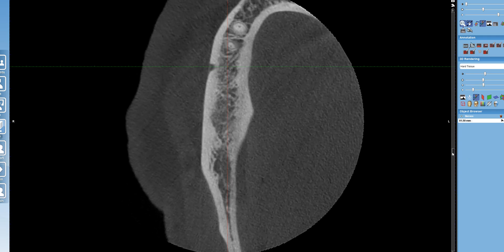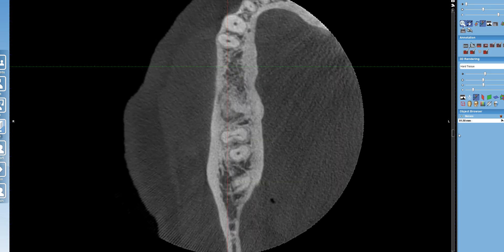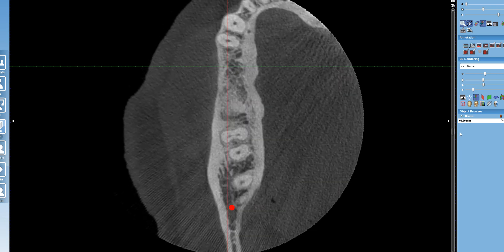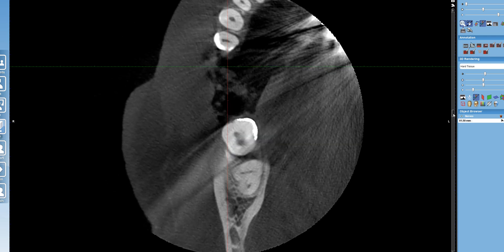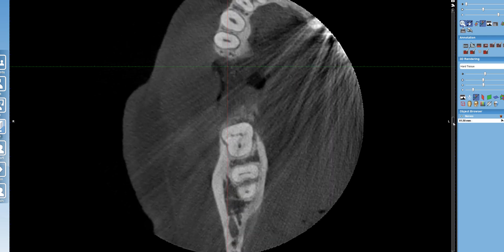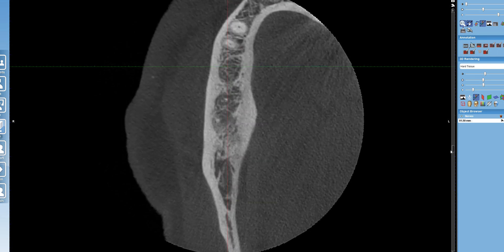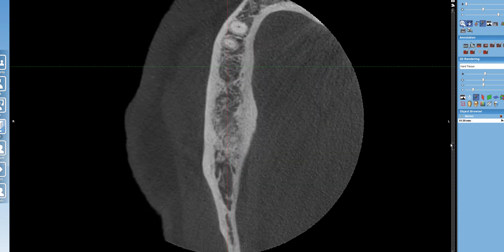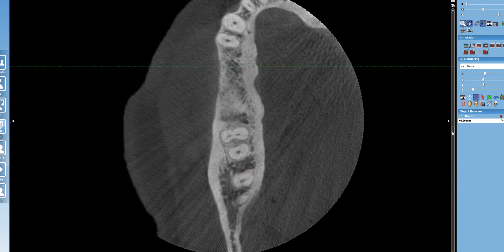I'm going to move the scan superiorly. What you're seeing here are the roots of canine, 27, 28; 29 is missing; 30 is missing and has been grafted; and number 31 and 32. So where is that mental foramen located? It's at the site of number 29.